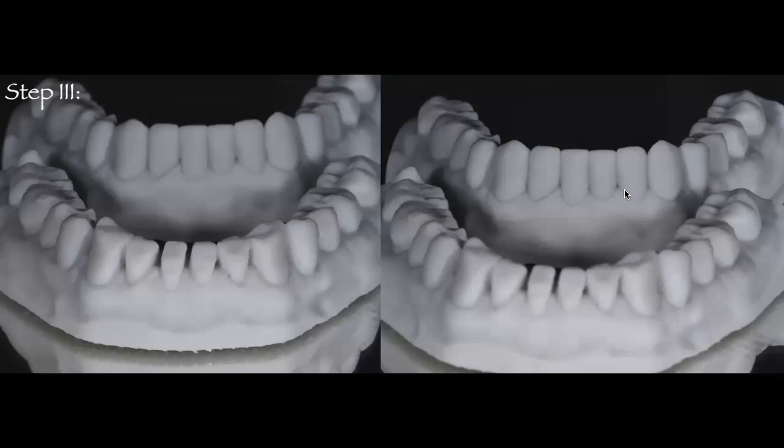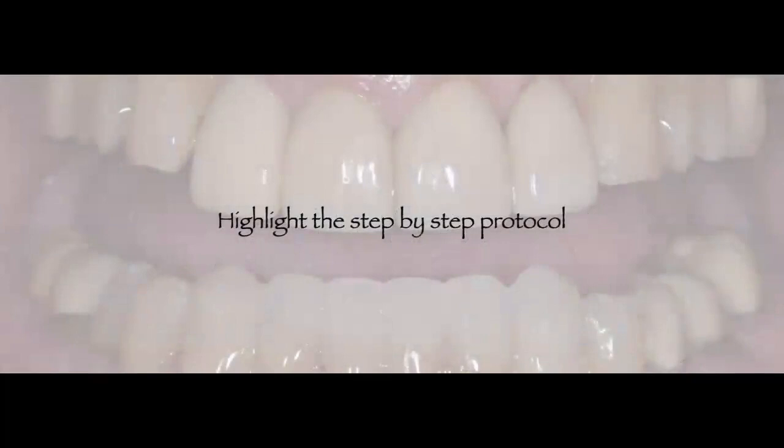Once we have these casts, we're going to take an impression using a clear PVS of this wax up, mainly for the mandibular incisors, so I can use that clear PVS to take this wax up into the patient's mouth and restore those teeth exactly at the same incisal height and exactly reproducing that new envelope of function. I'll do the same on the lingual surfaces of the maxillary incisors. So this takes us now to our objective number 3, which is to highlight the step-by-step protocol.